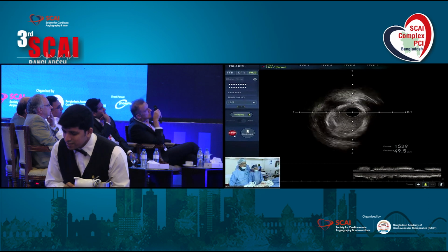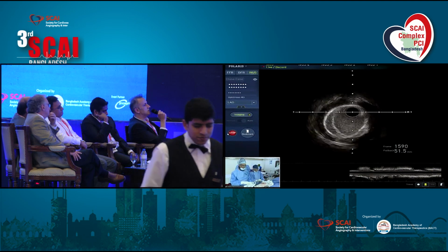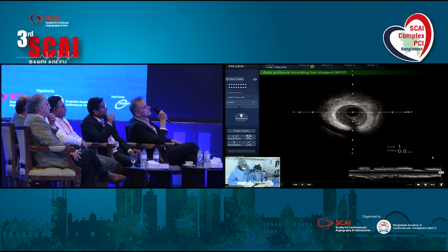Okay. Yes, I think very nice results. It's very good expansion. Yes. Yeah.